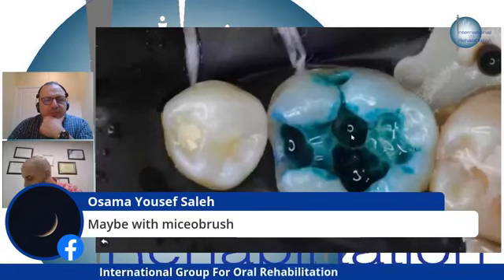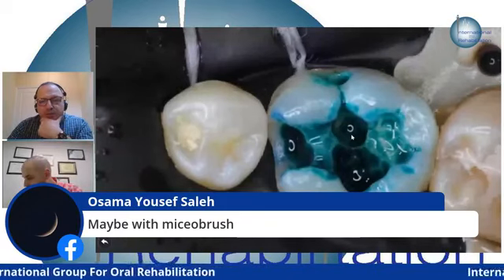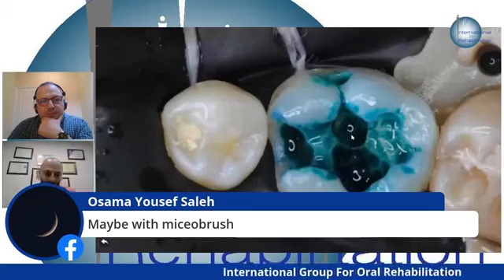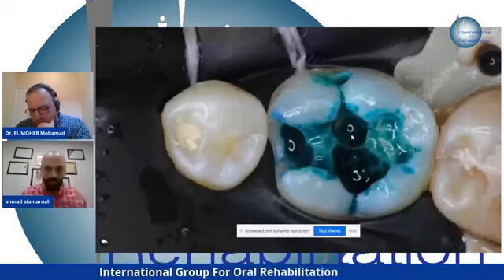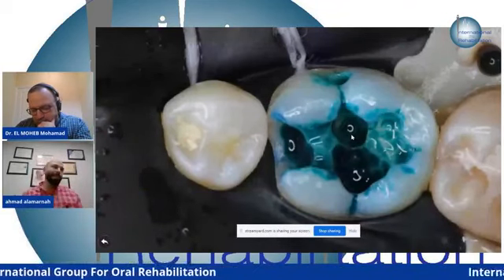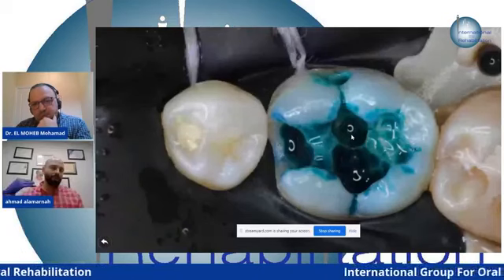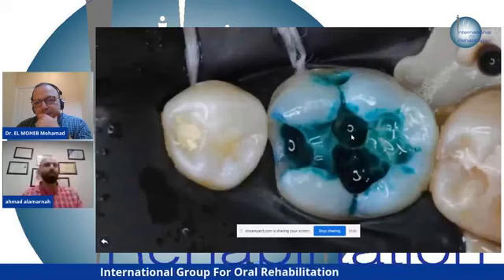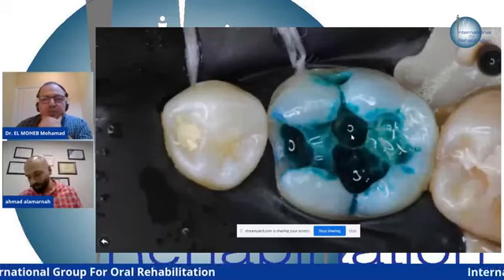Maybe with a microbrush. No, this is the application. We don't say anything about the application, but do we use it immediately after the preparation of the tooth, or do we have to do something else to the cavity and then use it? You must clean the cavity.